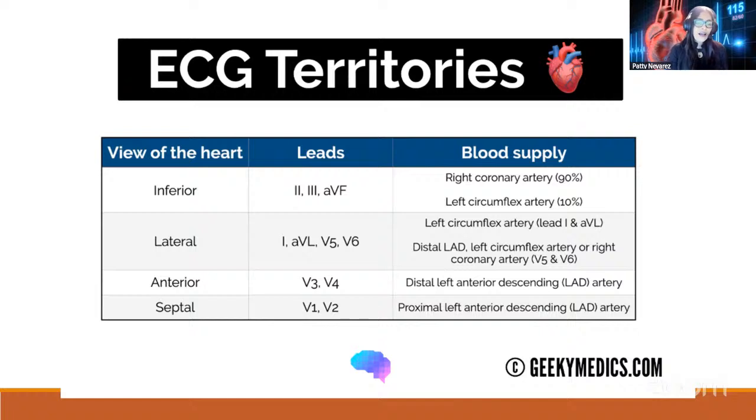And this image is also adding the coronaries, which is super important for us to know, because we are going to be able to notice where the STEMI is happening. Where is the blockage in the entire heart? We always need to investigate the right and left coronaries, but this is going to give us a very good idea of what is happening.